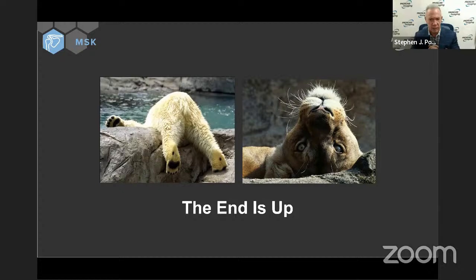It's an easy arthrogram to do. Why might I do it? I've got clicking or catching in a high-performance athlete, and I have not come up with an explanation on a non-contrast study. In that case, I will then introduce gadolinium into the intra-articular space to see if I can find a plica or a nasty fringe or a body.